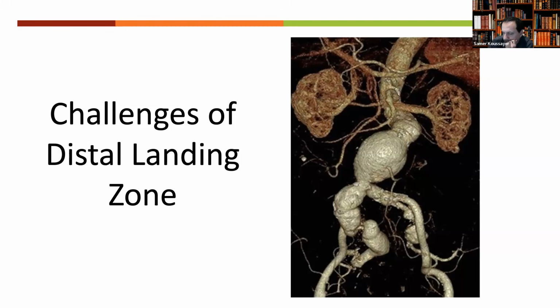Not really, but I saw a couple of cases where it worked very well. Yes, I agree with that. But again, you crack the calcium, but if the aorta is still narrow, you can compromise maybe 2-3 millimeters, but you cannot tell me I have an aortic bifurcation of 16 with calcification, you crack it and it's going to fit. It will not fit. You see my point? So definitely it worked, but within 1-2 millimeters of the IFU, which is 20. Again, 18 is acceptable, 17 maybe even acceptable, but lower than that I think is too much. Okay, thank you. No problem.